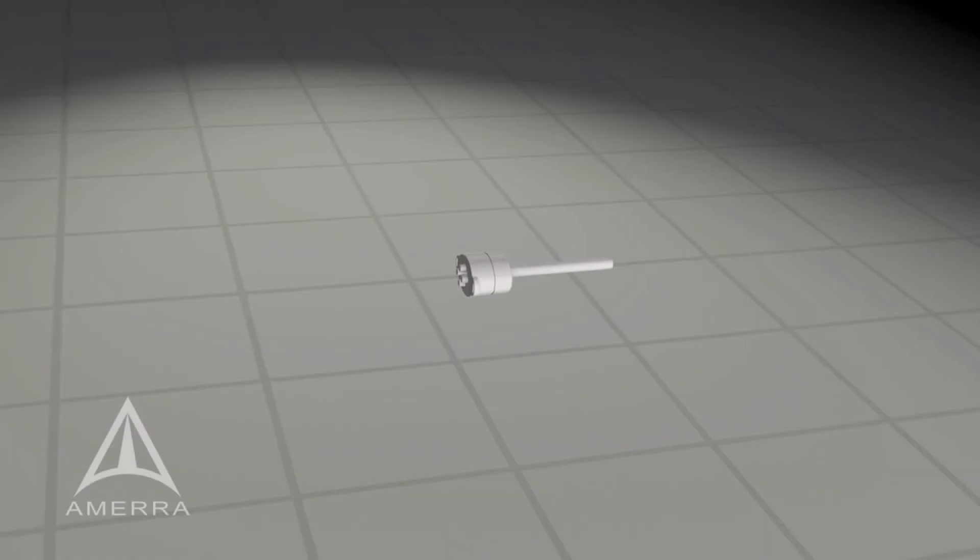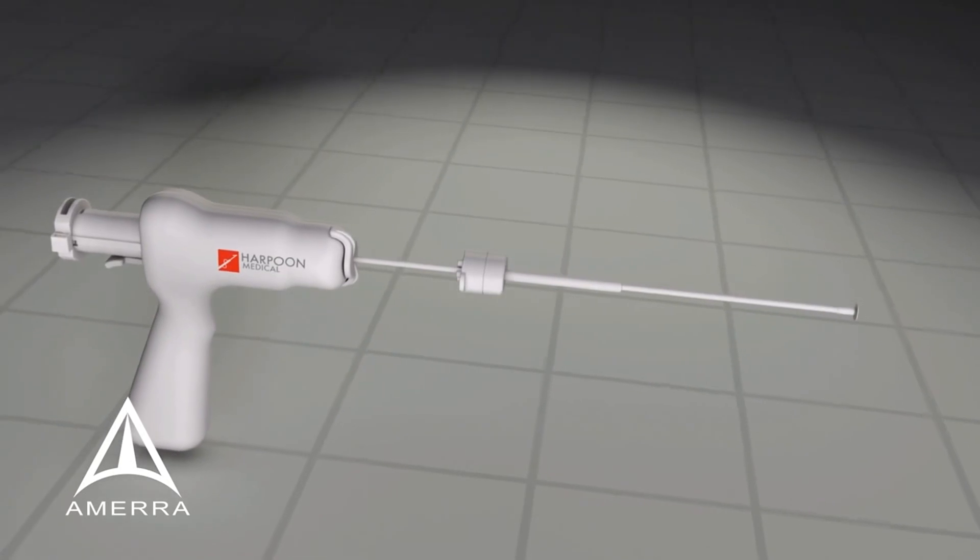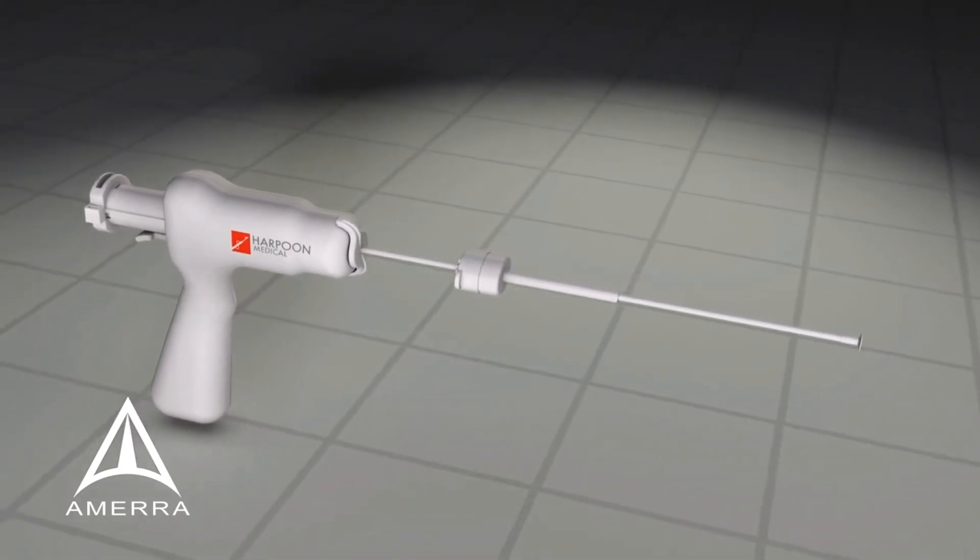Harpoon Medical is a development stage medical device company commercializing products for minimally invasive mitral valve repair. With the Harpoon device, surgeons can perform beating heart mitral valve repair.